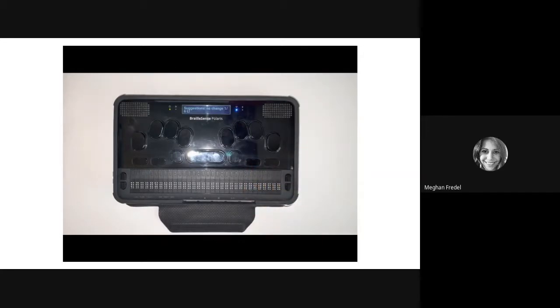The first suggestion is no change. Well, we know it's spelled wrong, so I don't want that. So I'm going to use my scroll buttons. Have, 2 of 6 list item. The next suggestion is "have," and if you check your Braille display, you will find the words that it's suggesting right there, so you can make sure that it's the choice you want. So this is the choice I want, so I'm going to hit enter. Word replaced.